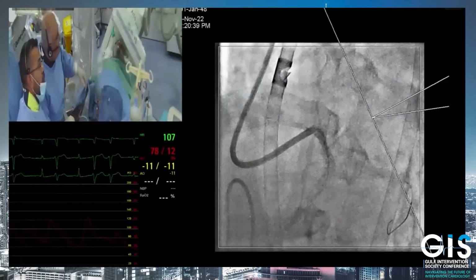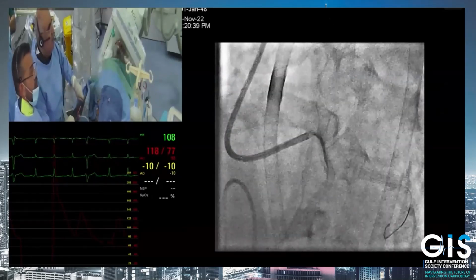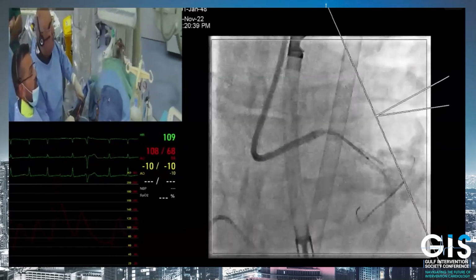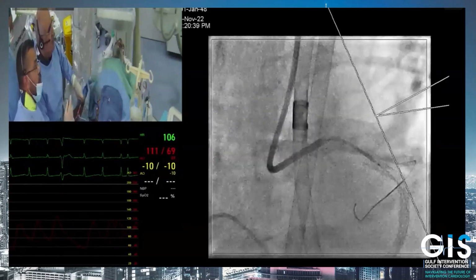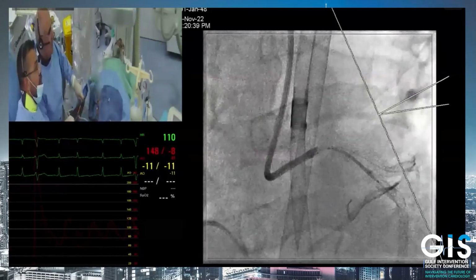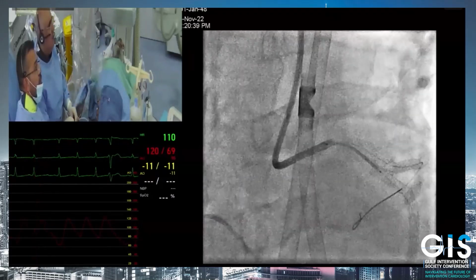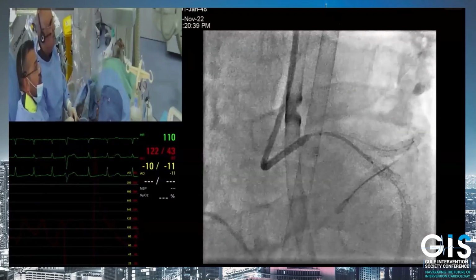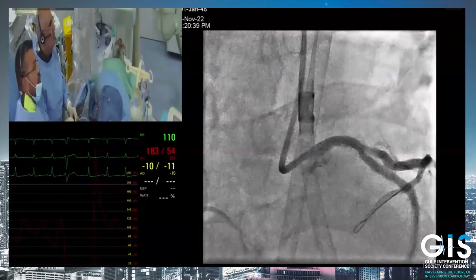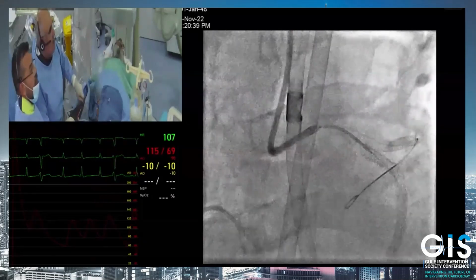If I go just for stenting the main vessel, I finish with the POT. If I do a side branch dilatation, I prefer to do POT, side, POT. In this case, what size of balloon will you use for a POT? Oh, it's a huge left main, I think at least 5. If you're going to dilate the circumflex, do you undersize or use a one-to-one balloon?